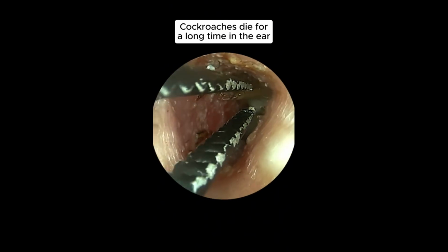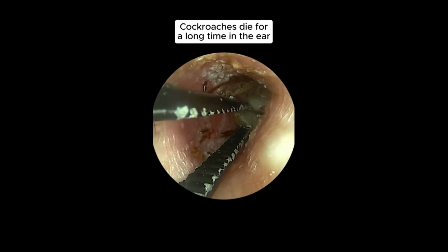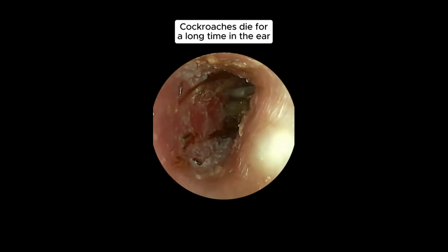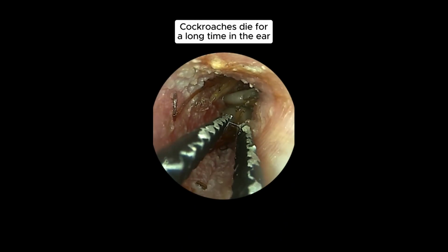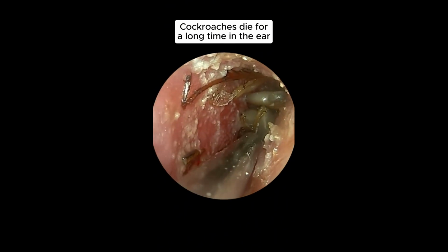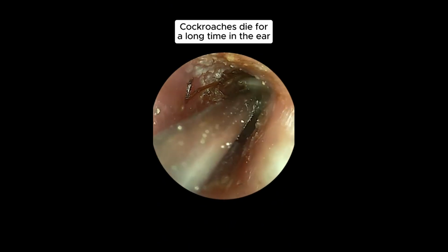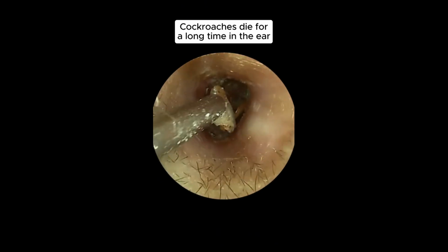So what you end up with sometimes is, you go into the ear canal and you can see where the ear canal was, and there's an eardrum at the end, which is what this patient has. You can't see it yet. But then you have this random enlargement of the ear canal, usually going posteriorly, so towards the back of the head. It looks like a backwards P, so to speak. And in this particular patient, the cavity, surprise, surprise, is filled with debris, which they often are, to be fair. And we get a lot of these.